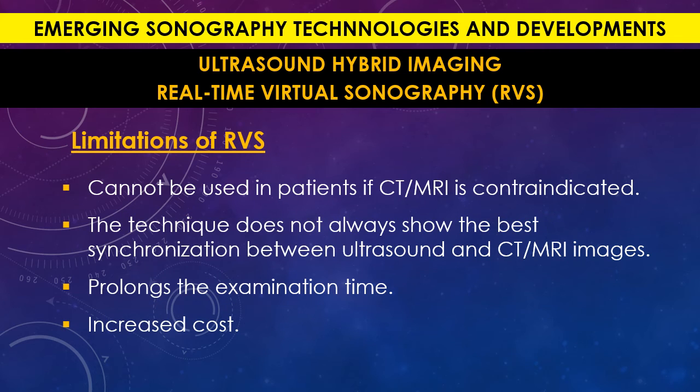So as we have seen the advantages, there are also limitations or disadvantages of this technique. Number one, it cannot be used in patients who are contraindicated to have a CT or MRI.